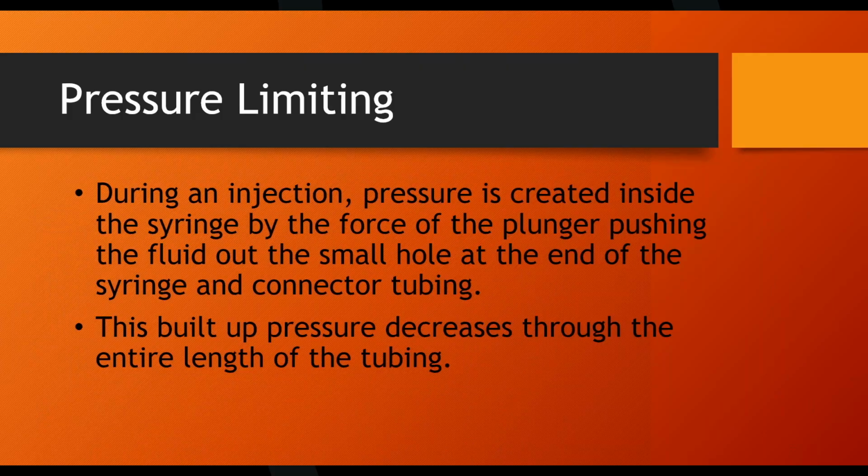So if I want to shoot an injection, I'm going to do this one first. Let's say I'll do a volume of 20 milliliters, and I'm going to shoot that at a rate of 5 milliliters per second. So the flow rate is the speed of the injection, and the volume is how much we're going to inject. All right, 2 different things.